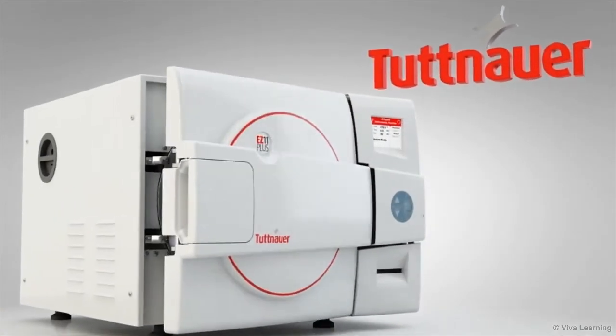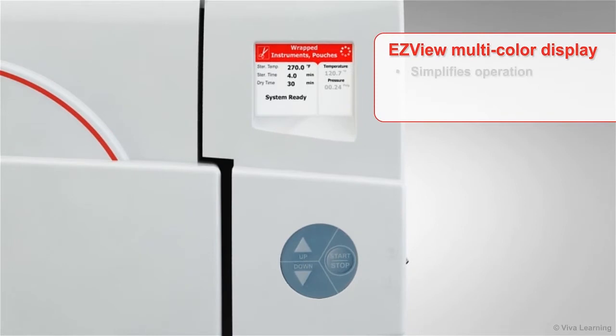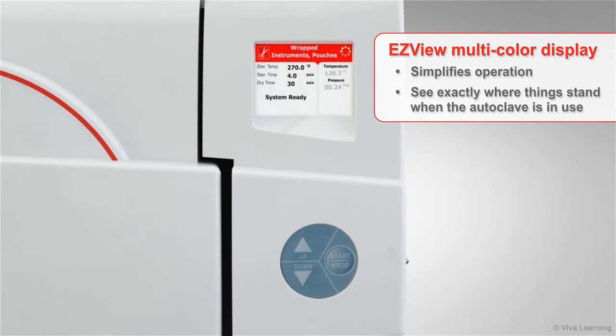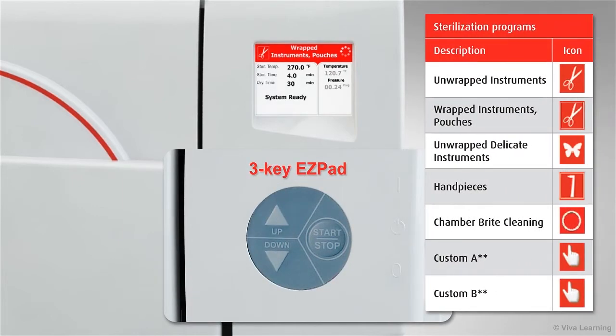Your staff members will also appreciate the way that the innovative EZ View multi-color display simplifies operation and allows them to see exactly where things stand when the autoclave is in use, even from a distance. Use the three-key EZ Pad to quickly see and select the appropriate sterilization program for each load.